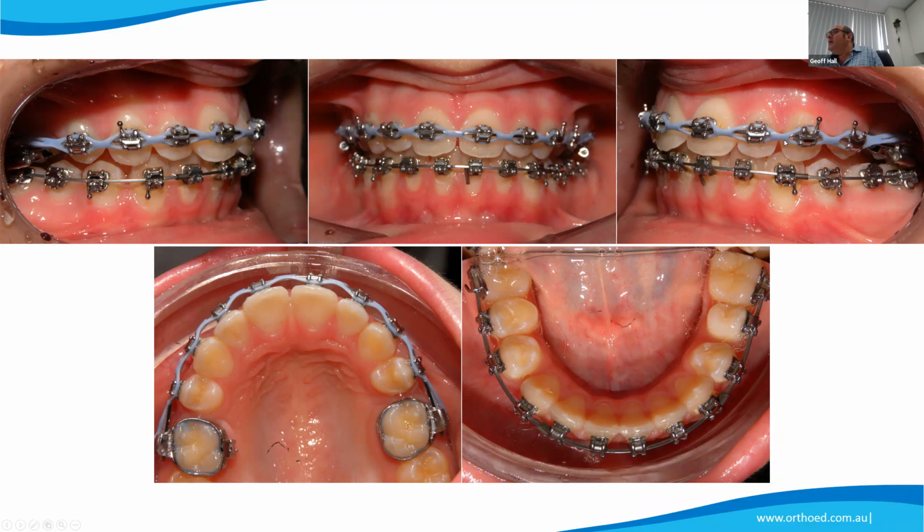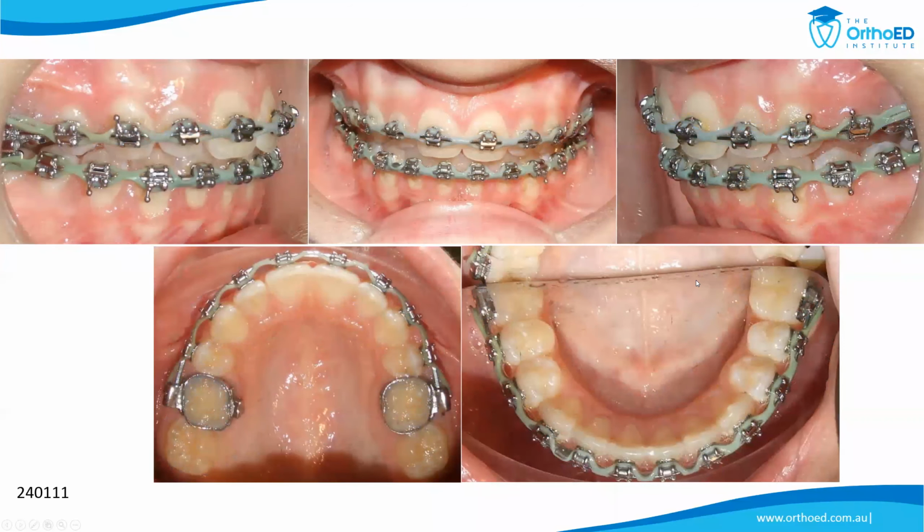So it's important that you put the stops in the right area, but basically as a rule of thumb, if you put the stops distal to a tooth on each side, the wire can't slide around, but also it can slide back to allow space closure to occur. Does that make sense? Yeah. Yep. Okay, so here we are.